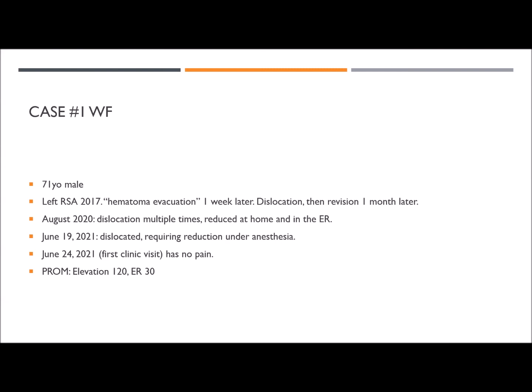Yeah, there's one of the implant companies that I used. It was based on putting the glenoid more inferior to prevent the notching and that kind of thing. But it was an onlay humerus, and so again, like you said, it put a lot of tension on the deltoid.